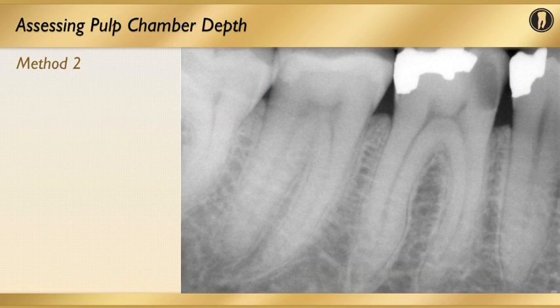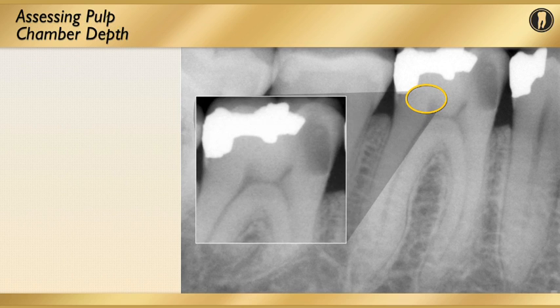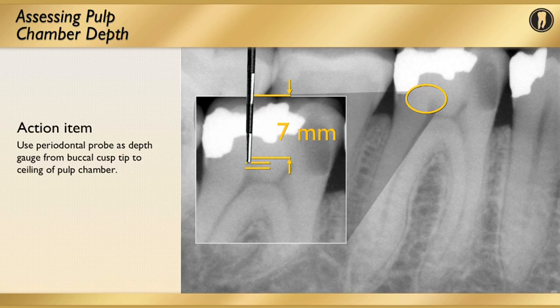Our examination of method 2 will continue with looking at number 30 on the mandibular arch. Utilizing this method again, we notice that magnification will allow us the opportunity to better see not only the anatomical variations, but the anatomical realities within the tooth. Notice here that we can clearly see through magnification the pulp horns both on the mesial and distal of tooth number 30, which will be an important reference point for us in determining the penetration depth of our posterior access for this case. That's represented by the yellow line from a distance to a point at the highest anatomical point visible on the radiograph.